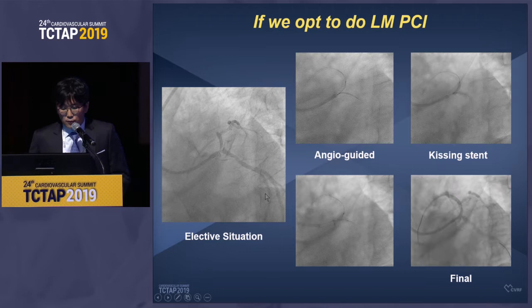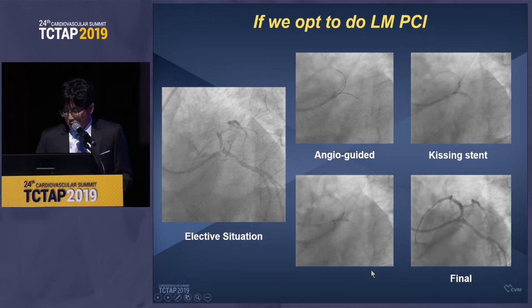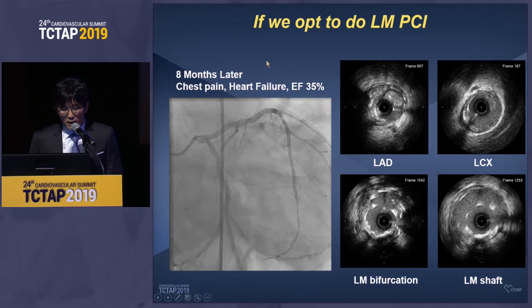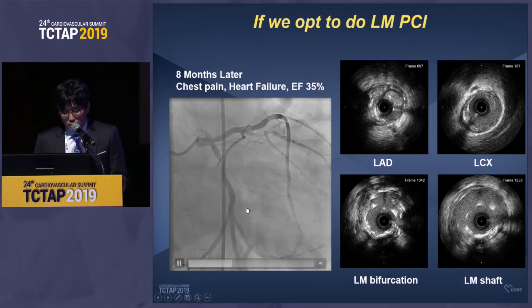That's the key. This patient had a LAD CTO and a significant left main bifurcation disease. The operator did an angio-guided kissing stent in an elective situation, and this was the final result. The patient was on guideline-directed medical therapy, but 8 months later he experienced chest pain and heart failure. After stabilization, we took an angio. We had to explain the phenomenon. We did the FFR. The LAD FFR was 0.36, circumflex 0.67.